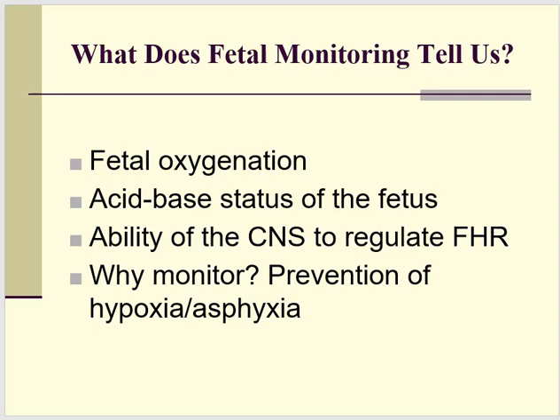That acid-base status tells us the ability of the central nervous system to regulate the fetal heart rate. If our central nervous system is working well, we expect the fetal heart rate to do certain things. If it does not, we question the oxygenation of the fetus. By monitoring, we hope to prevent hypoxia and asphyxia, which can lead to some bad things.